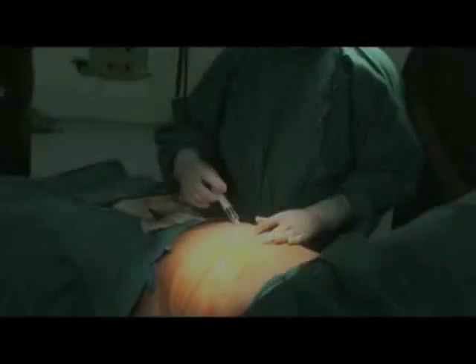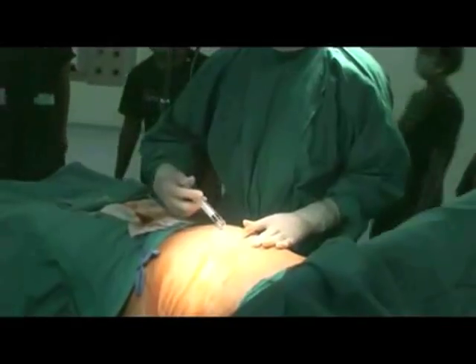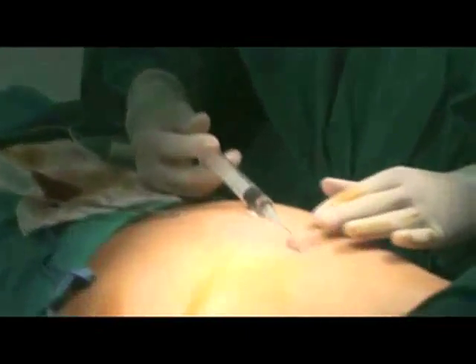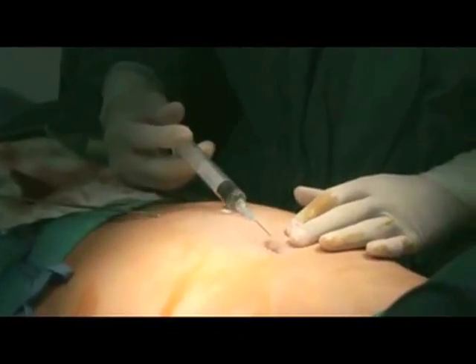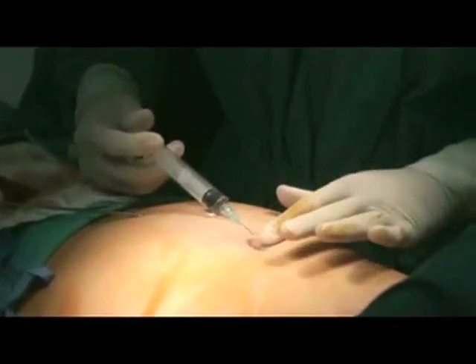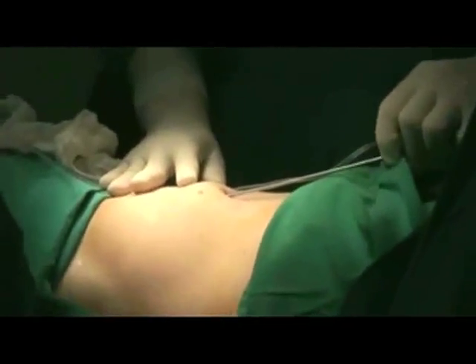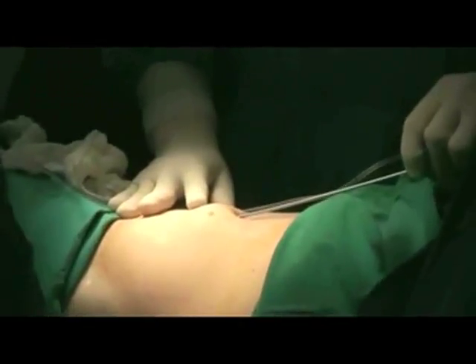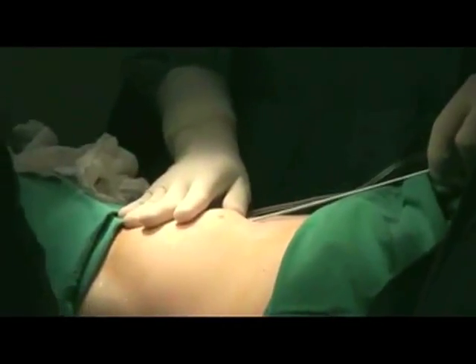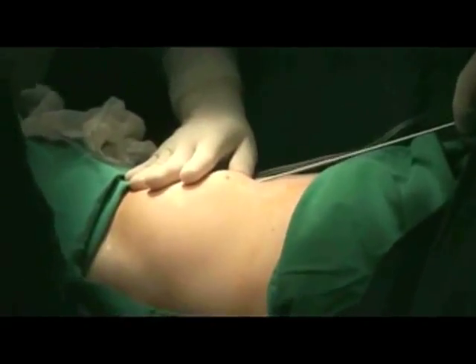To begin the manual liposuction procedure, inject local anesthetic into the patient's abdomen. Next, inject tumescent into the fat layer between the skin and the muscle. Wait 20 minutes for the tumescent to take effect.